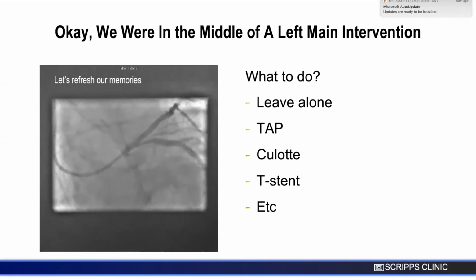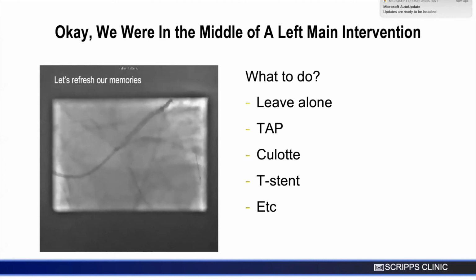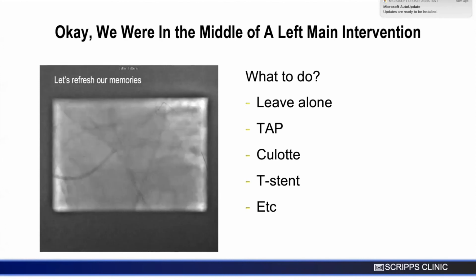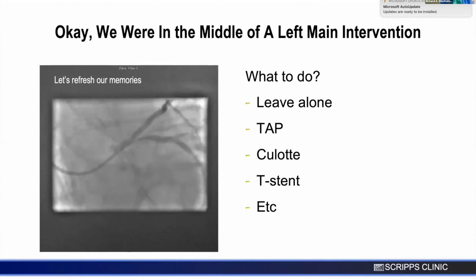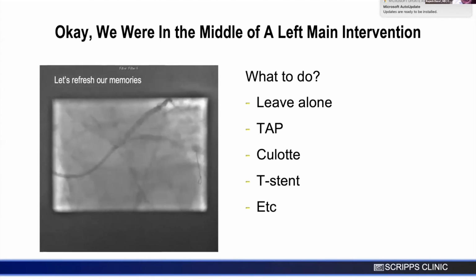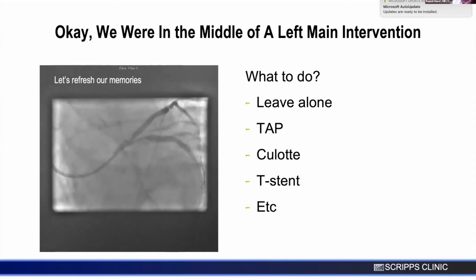I would try to think about a TAP. I mean, the left main is not the largest vessel here. You know, you could do a culotte, but yeah. Why not do a culotte? Tanvir, you know, it's really a narrow angle. I think the circumflex, at least to my eye, looks like a minimum 3.5 millimeter vessel. But I would put in a 3.5/18 stent extending from circ into the left main, and then do another kissing inflation.